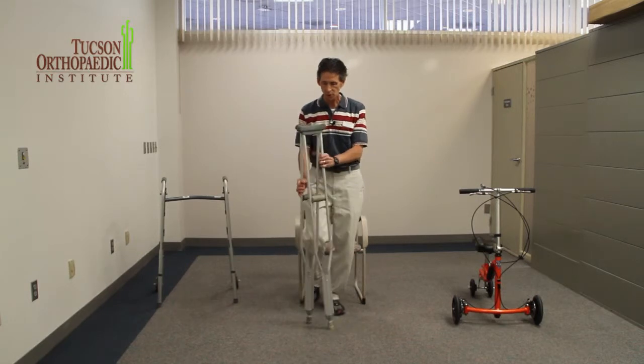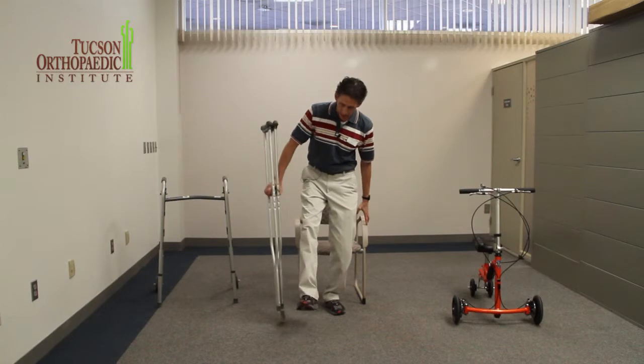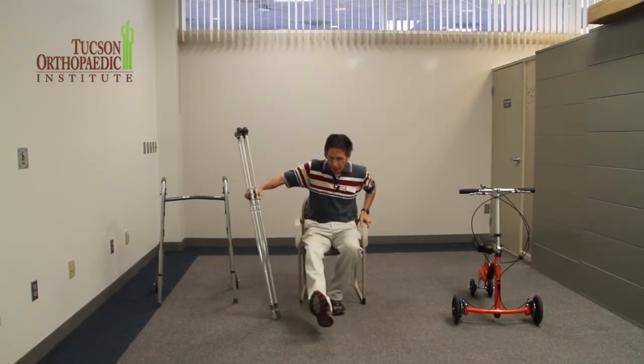Then what I'm going to do is put the crutches all on one side, have my leg out of the way so I don't touch the floor, reach back with my left hand, use my right hand, lower myself down, and I'm back.